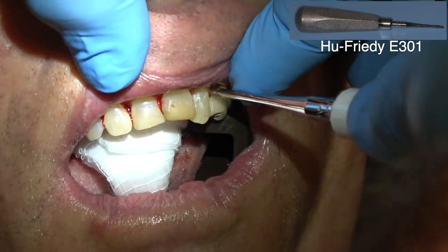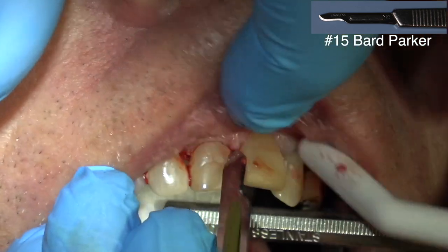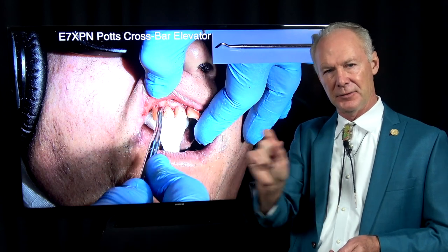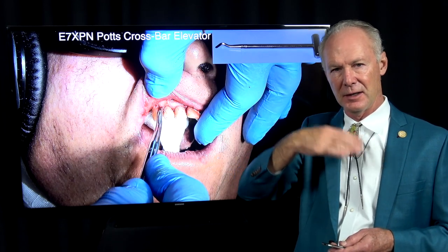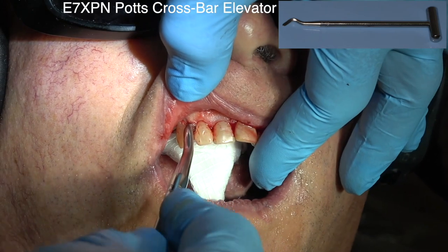You want to get some movement before unscrewing those teeth. One important thing that's often overlooked when placing a denture — it's just like All-on-4. When surgeons place All-on-4, they cut the alveolar process back two or three millimeters. Because if you don't — if you just take the teeth out and leave the alveolar process at its original height — your denture or your All-on-4 is too tall and your bite is going to be open. So you want to remove some of the alveolar process when you extract teeth for a denture, just like you do for an All-on-4.